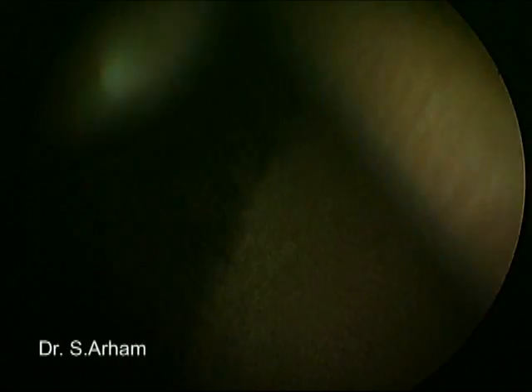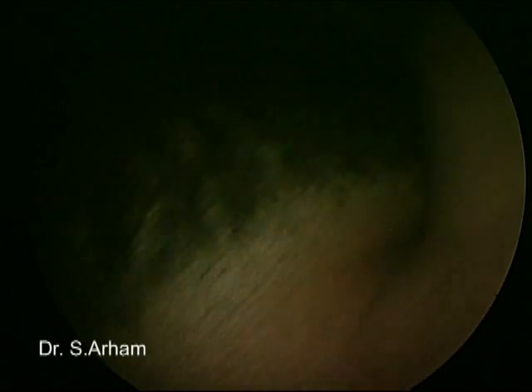Over a period of time, the facial paralysis improved in this case. You can see the post-aural area — there is no scar in the post-aural region or in the endaural region. This is a case done through the canal using endoscopes.